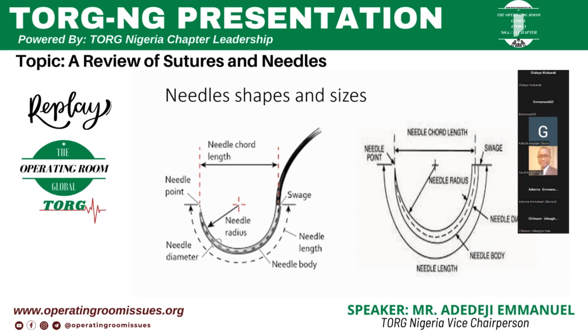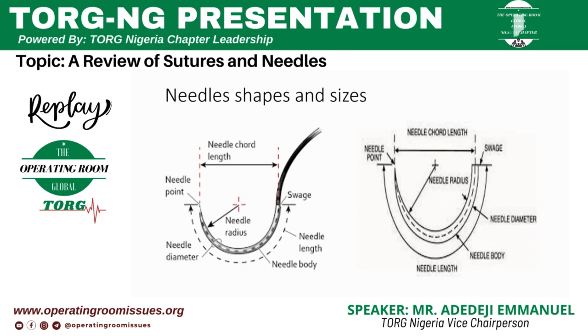I will throw the materials to us on the platform, but just permit me the way I can describe it for the sake of this meeting. So basically that's what you see, needle. Different needles are used depending on, for example, if you are suturing muscles. Even muscles are not usually sutured.